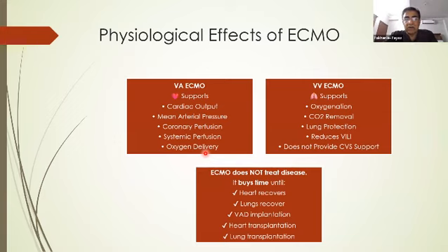And in the meantime, the time which we buy during that period, the heart or the lung will recover. Or if they don't recover and the patient is a transplant candidate, then we can go for the heart transplant or the lung transplantation. Or as a destination therapy, we can do the ventricular assist device implantation, etc. But there are certain criteria for all that, which I will not be discussing. It's not in the domain of this lecture.